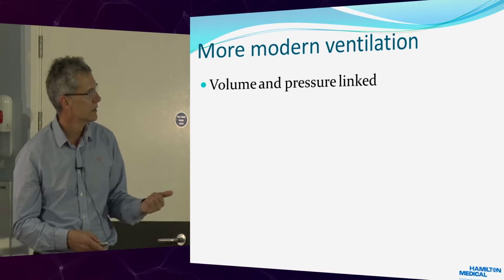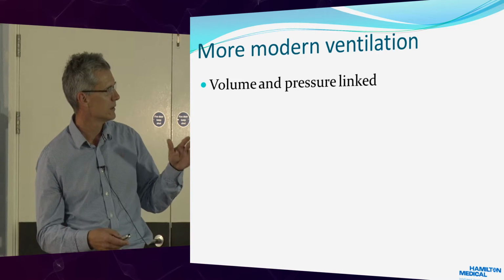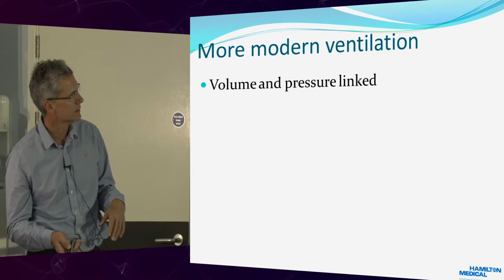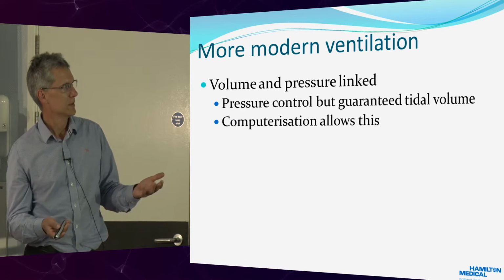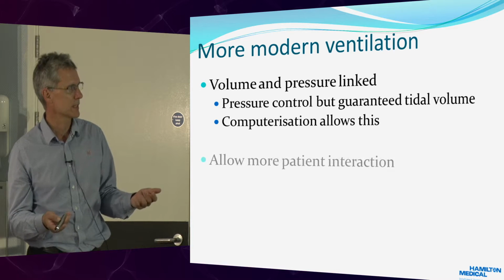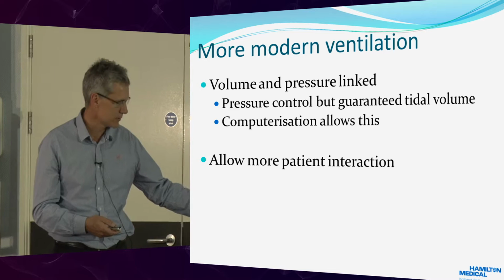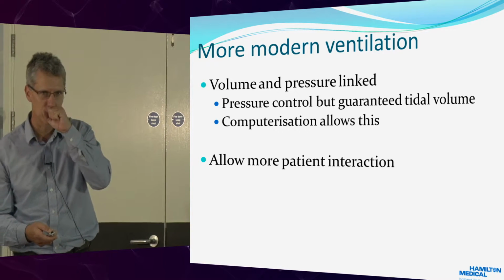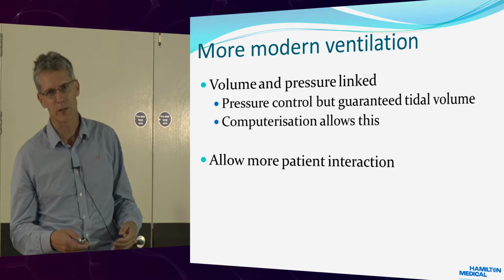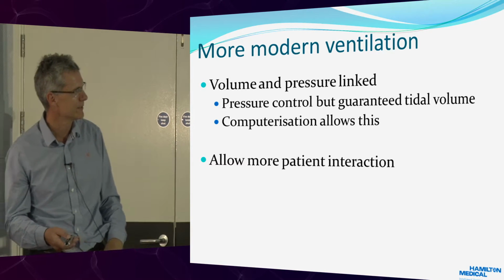Yep. I think the anaesthetic department in our theatre suite have machines which do a pressure control but volume guaranteed mode. So pressure control, but it guarantees the tidal volume, and computerization allows this. We run a basics course in Reading, and we get the guys on the course to breathe through this ventilator and try the different modes. You can actually tolerate it quite well as long as you don't set high pressures.